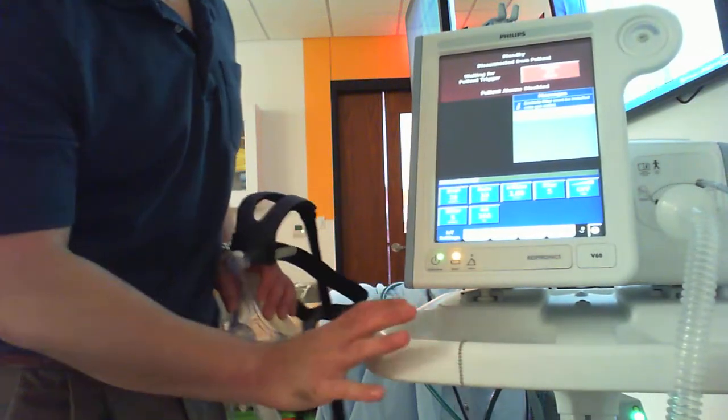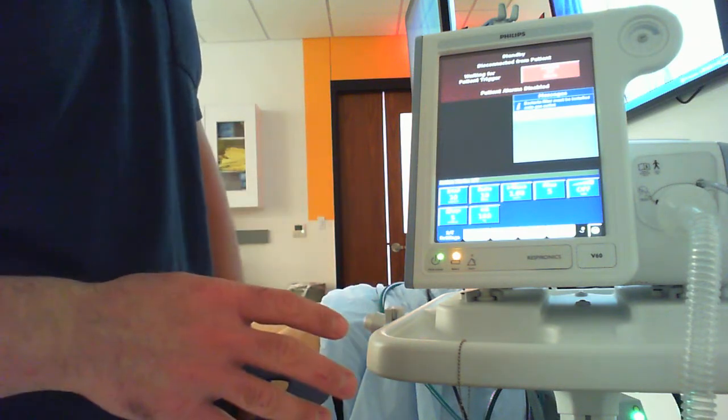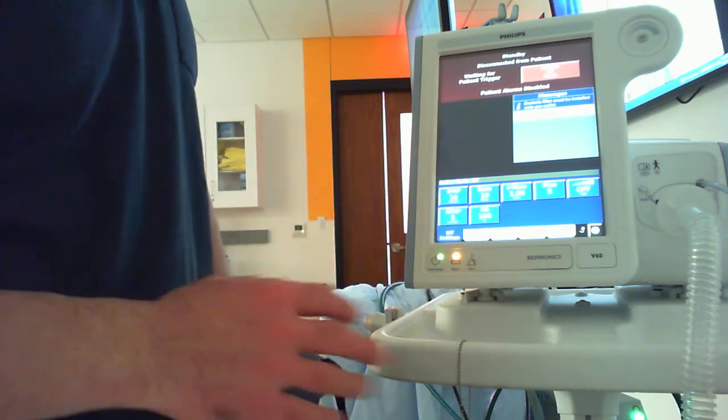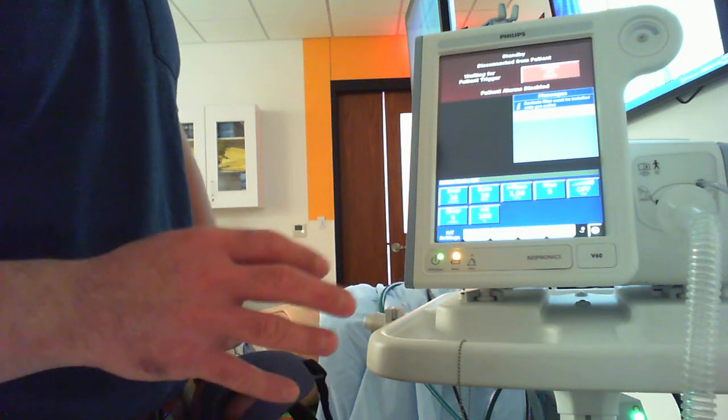All right, so we have no idea what settings this patient is going to need, okay? People can order 10/5 all day long, but at the end of the day, I need to be there and see what's going on with that patient. We'll talk about titration here in a little bit.